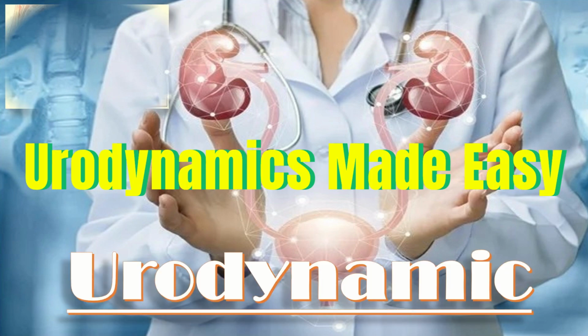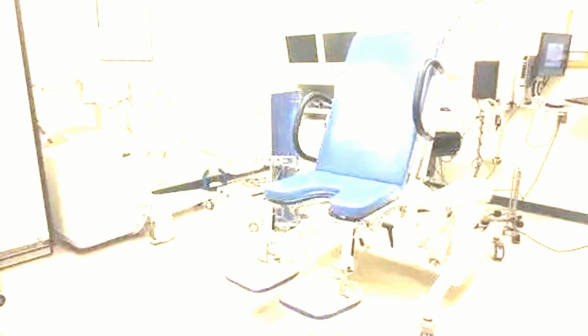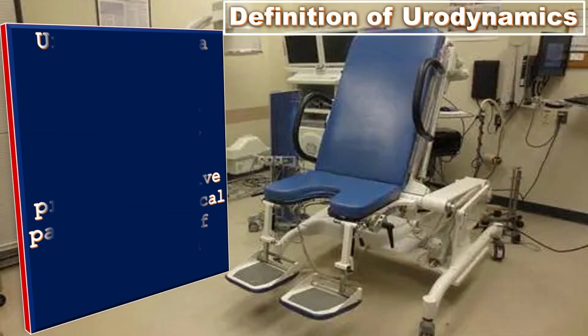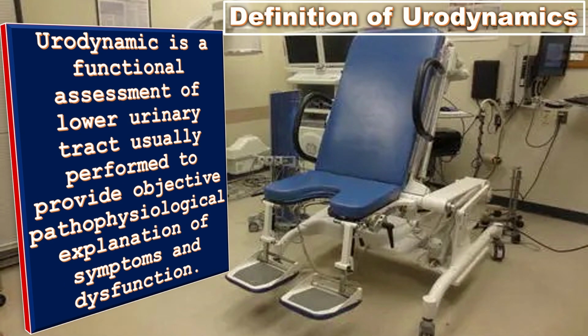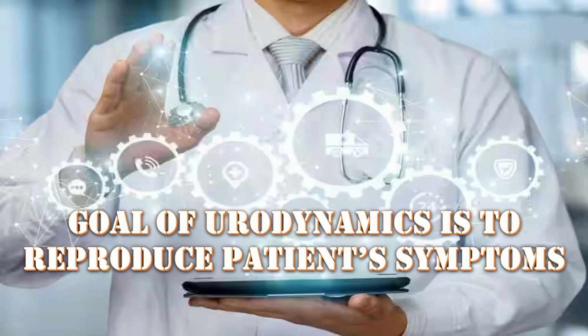Urodynamics is the topic of our discussion today. What is the definition of urodynamics? It is a functional assessment of the lower urinary tract, usually performed to provide an objective pathophysiological explanation of the symptoms and dysfunction. The goal of urodynamics is to reproduce the patient's symptom.